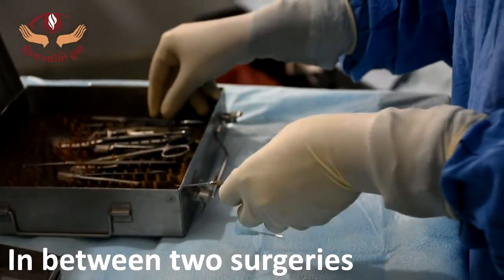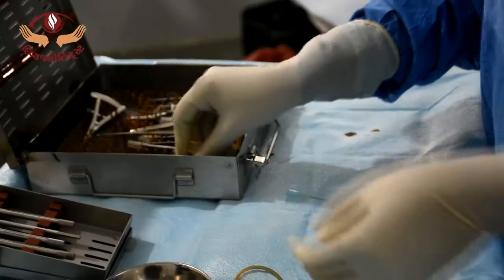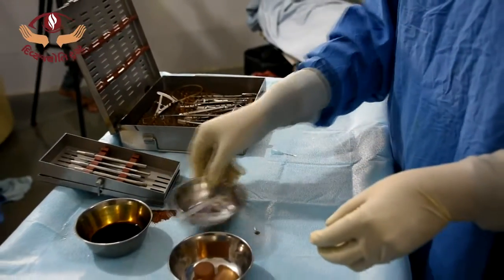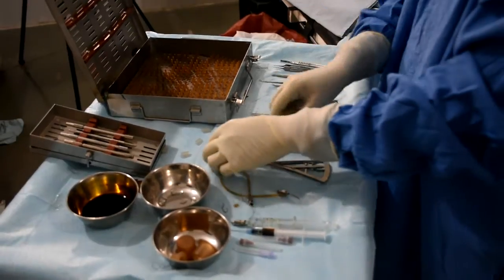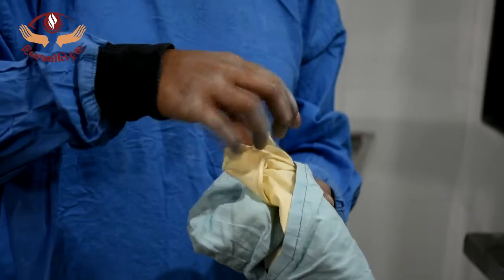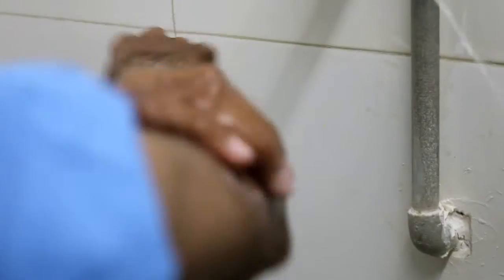In between two surgeries. RL, viscoelastics, SICS blades should not be used on to the next patient without re-sterilization. Surgical instruments set including SICS blades can be autoclaved. Gloves must be changed after each surgery. Ideally, one should re-scrub after each surgery for 3 minutes.